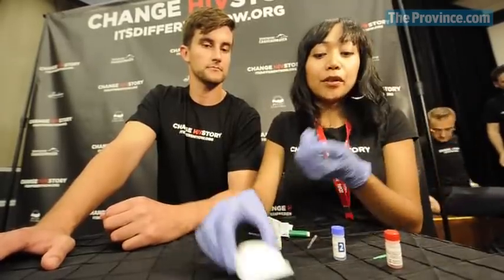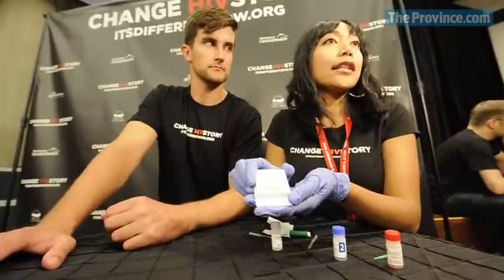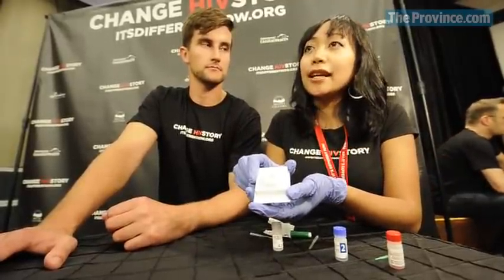It's important because it's another option that people can choose when they're interested in having an HIV test. There's the standard HIV blood test that a nurse takes from your arm, but there's also this, and the advantage to this is that we actually know the result in 60 seconds.